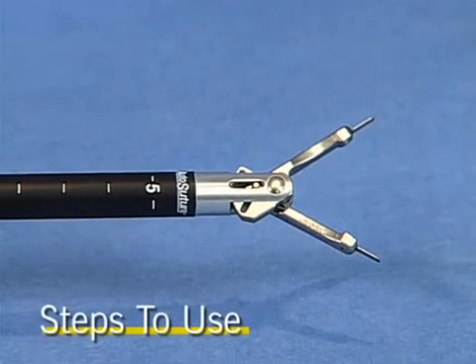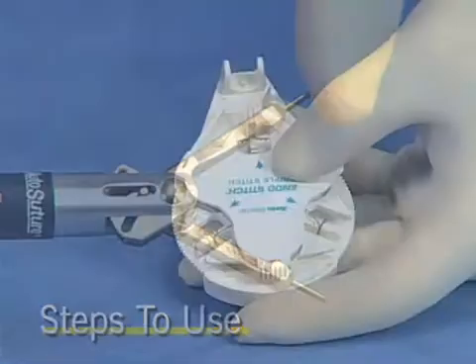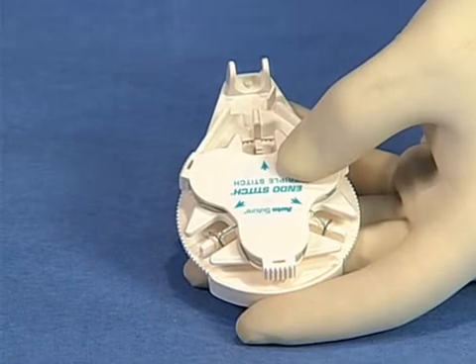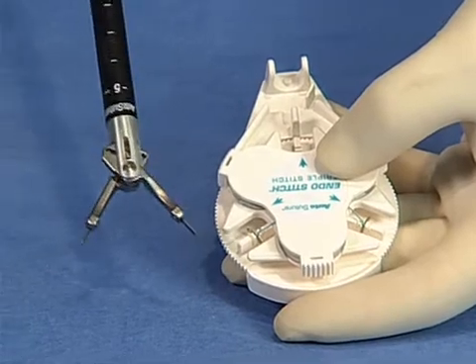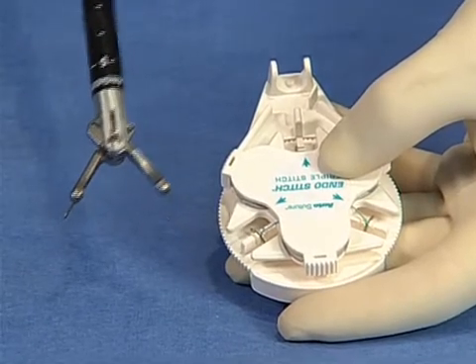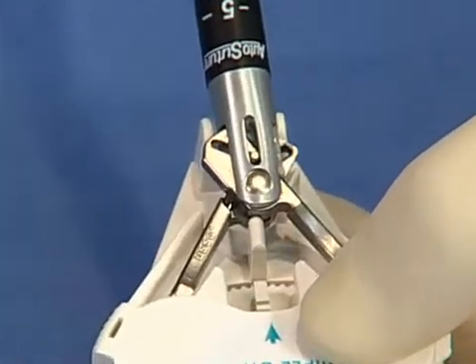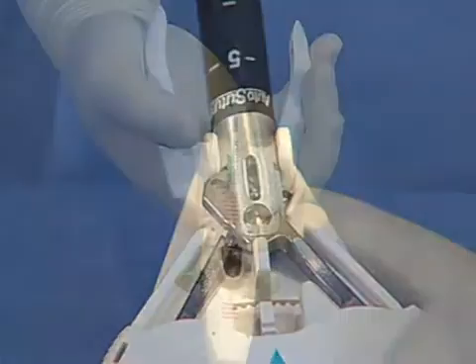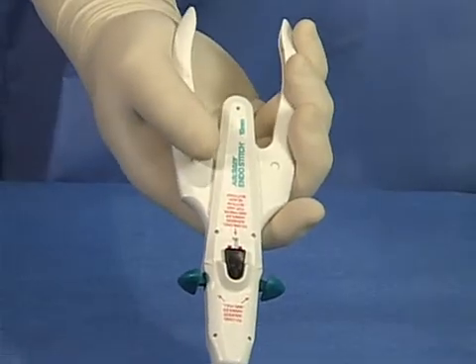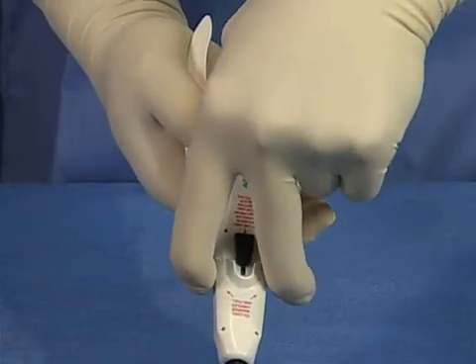Prior to loading, ensure that the metal bars are fully extended. To load the EndoStitch single-use suturing device, insert the open jaws of the device with the AutoSuture logo facing up into the single-use loading unit or SULU housing as shown. Press firmly on the apex of the jaws to ensure the jaws are fully seated. Completely squeeze the handles and pull both toggle levers back until you hear an audible click.